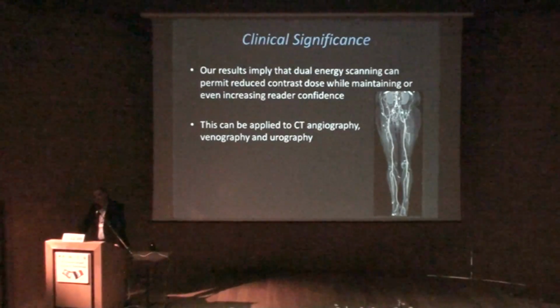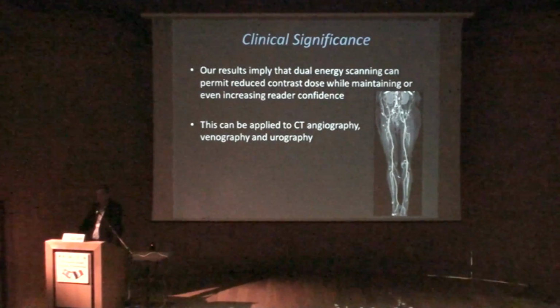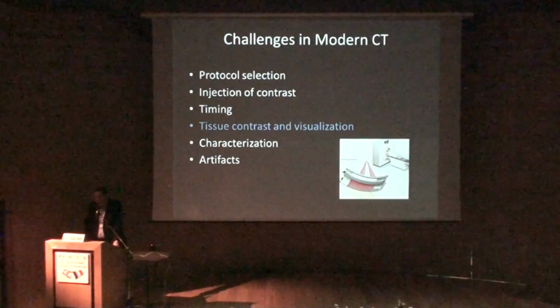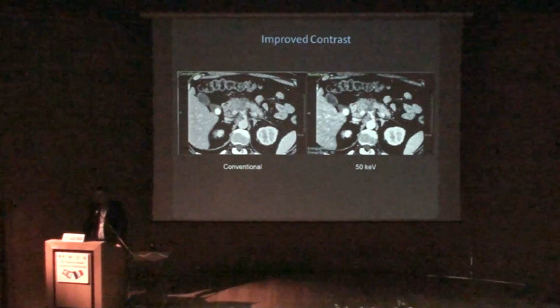It takes 7 hours before and 7 hours after. But if we can decrease the dose to 10, 15 cc's of contrast, it makes a big difference. Let's move now to tissue contrast and visualization.